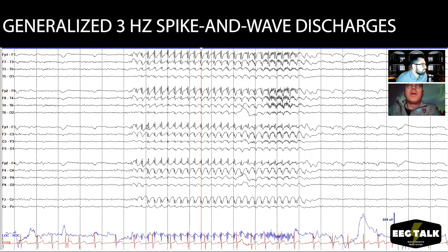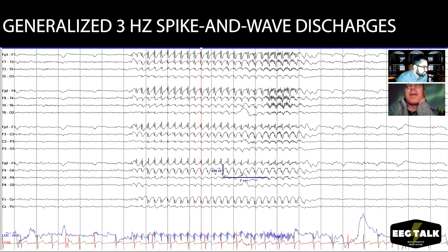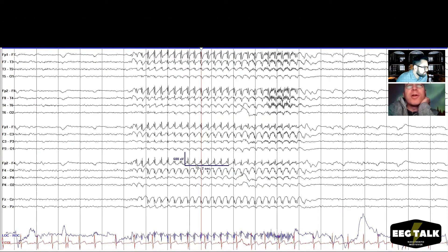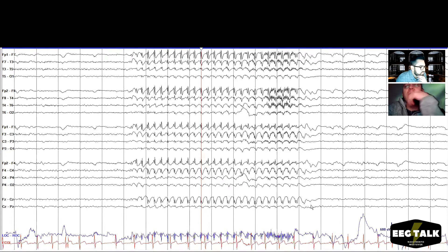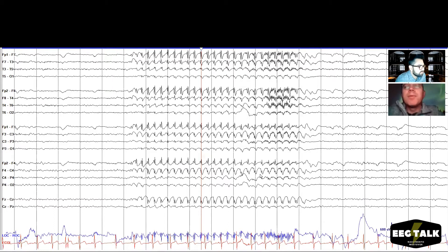We should also measure the amplitude of the spike and the wave. Let's take a look — maybe 350 microvolts. Yeah, these are tall. About 300-350 microvolts seems right. The slow wave is slightly shorter, maybe 300 microvolts, at least in the front. These are big slow waves. Most of our generalized spike-waves are actually more prominent in the frontal regions — that's really typical.